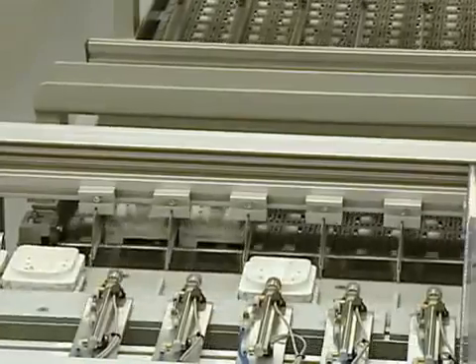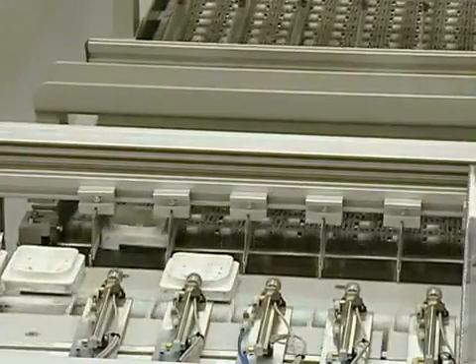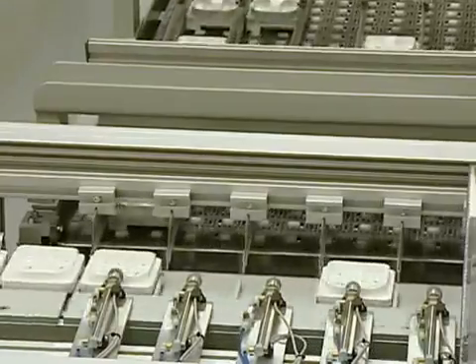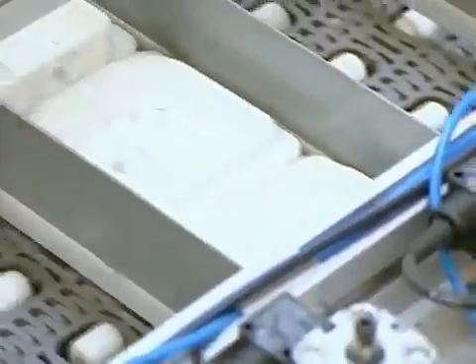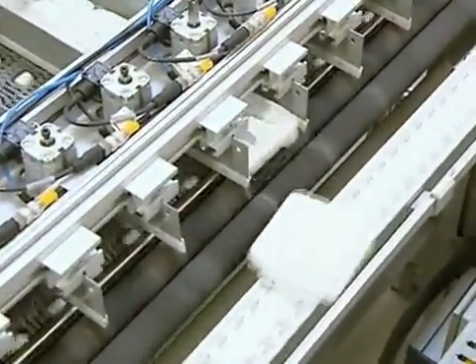Stations along the carousel are assigned to a particular patient ID. As the pucks come down the carousel, aligners that match a station's assigned patient ID are pulled into that station. When all the aligners related to that patient ID have been pulled into that station, they will be released back into the carousel for the next stage, sequencing.